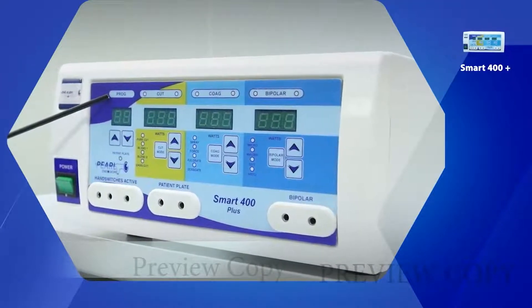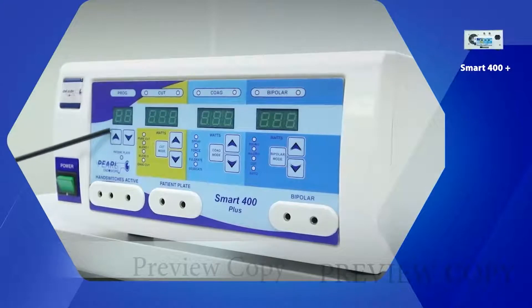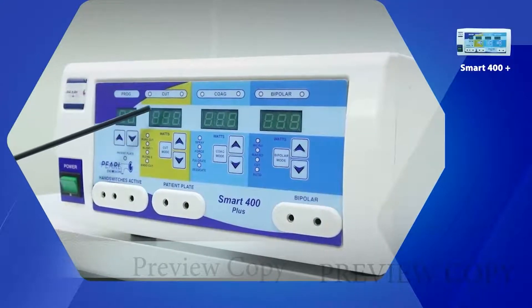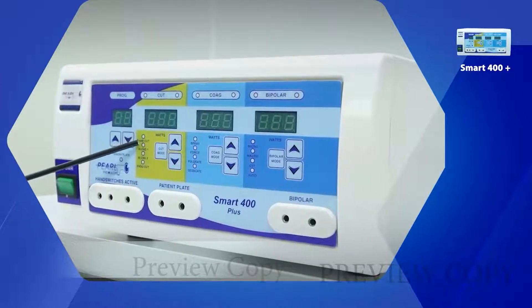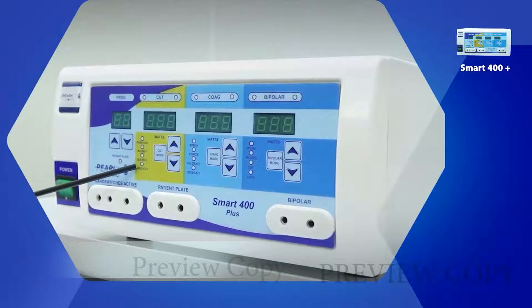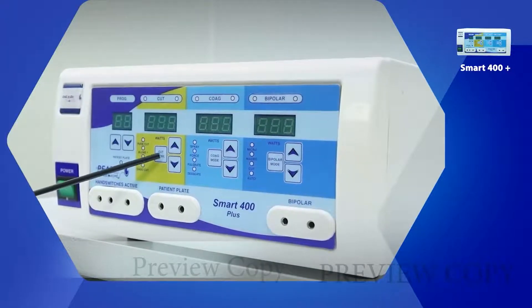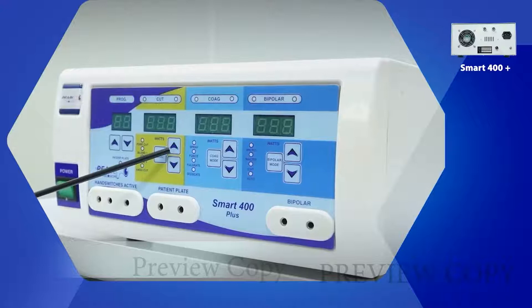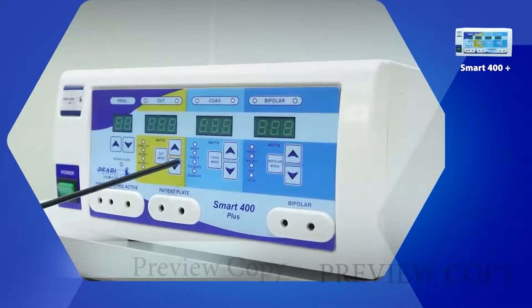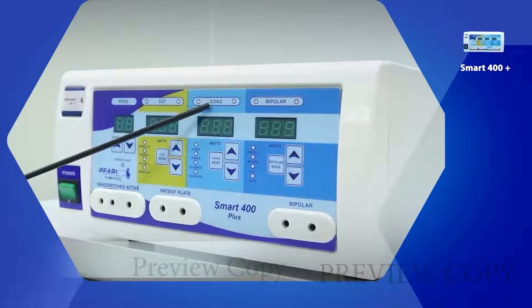This is the program and control area with the upper key and the lower key. This is the cut section, which has different modes: pure, blend 1, blend 2, and endocut. This is the cut mode change button and the power up and down button.